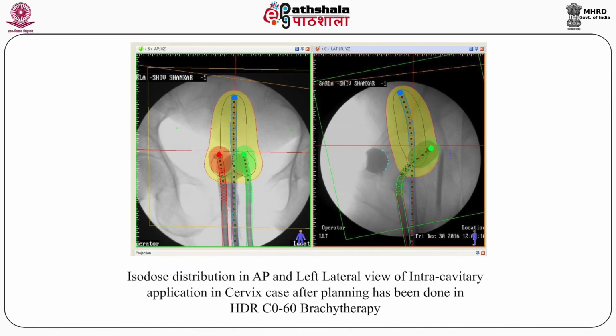In recent HDR machines where a cobalt 60 source is used, for safety purposes certain laser welding is required while making the cobalt source, to protect the source from deterioration and damage. Stainless steel material is used in the applicator, and universal plastic tubes are used in these applicators, and the source moves in the universal plastic applicator.